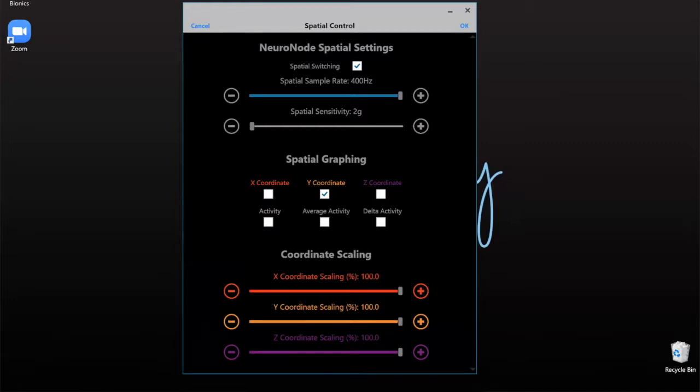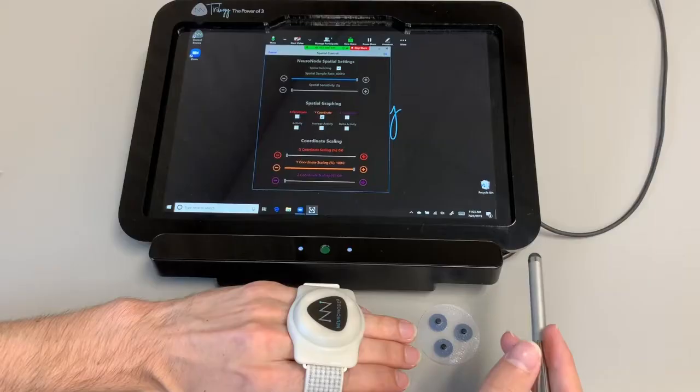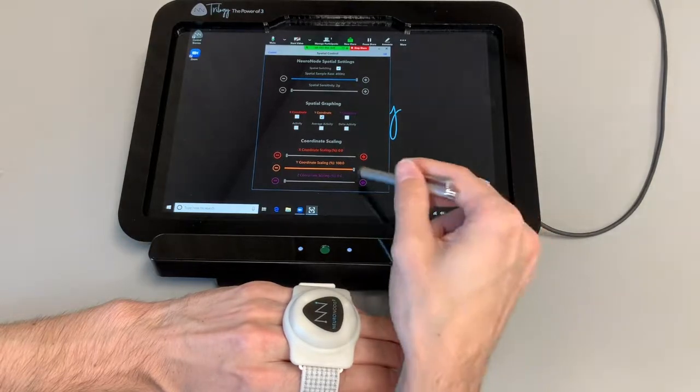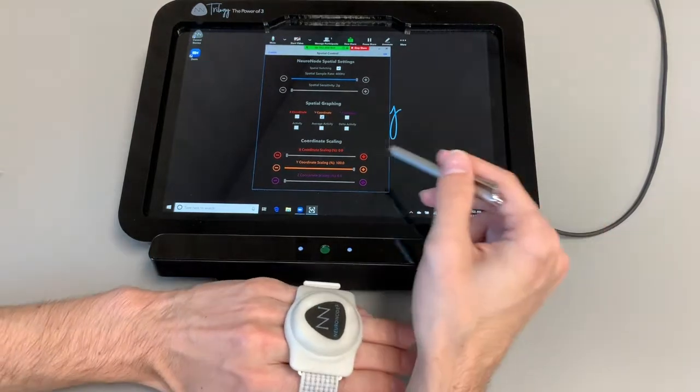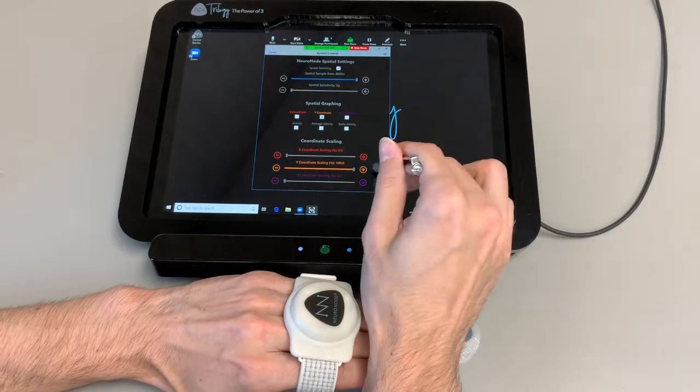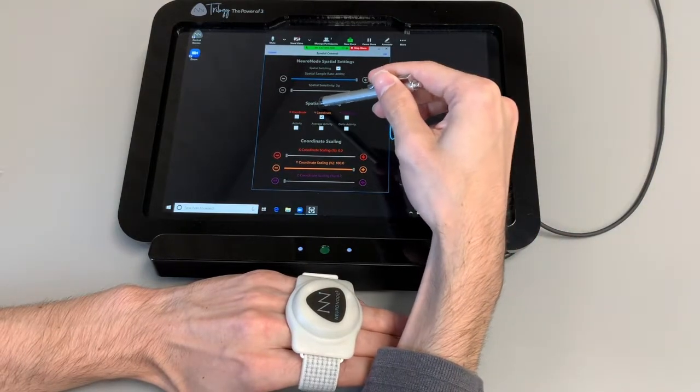We're also going to come down to these scaling lines and turn the red one down to zero and the purple one down to zero. There are scenarios where you may have two of these going at the same time, but what we're doing here is making it so it's basically counting 100% of that orange line's activity, and not counting any of the movement on the red or purple line with the zero values. So it's not going to read me moving it up and down as a switch. We just want this side-shaking motion — focus on the orange one being at 100%, this Y coordinate being checked.